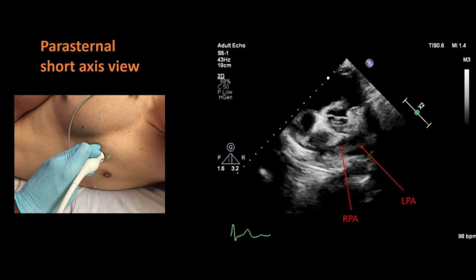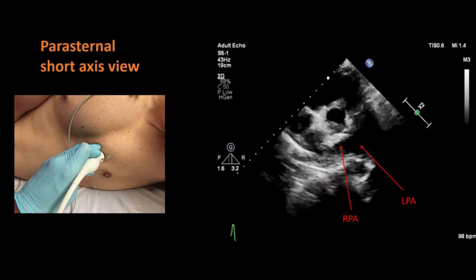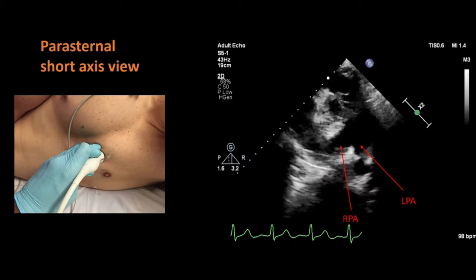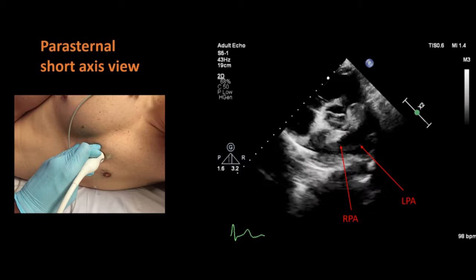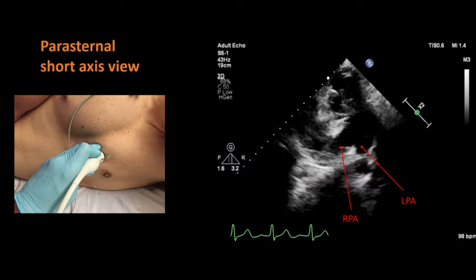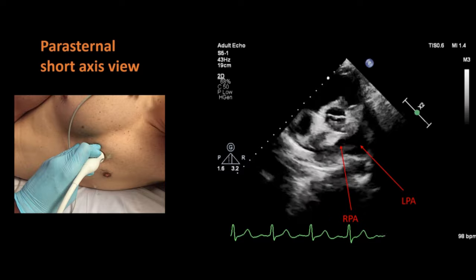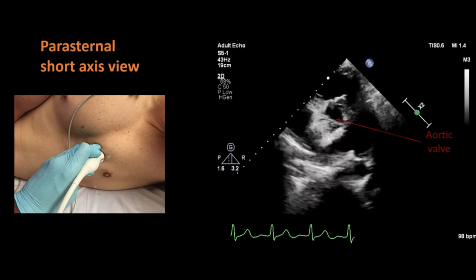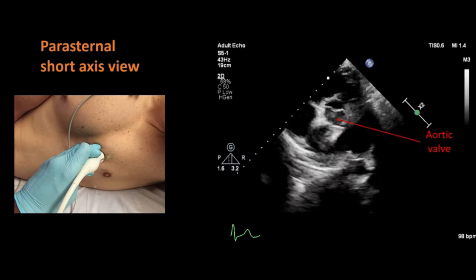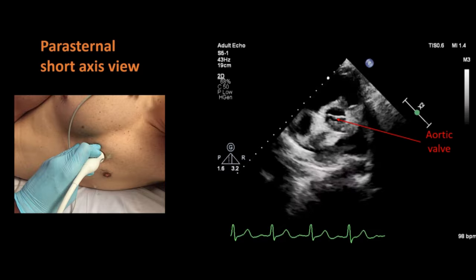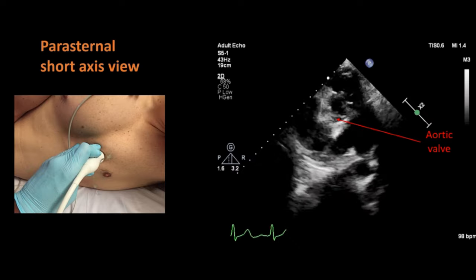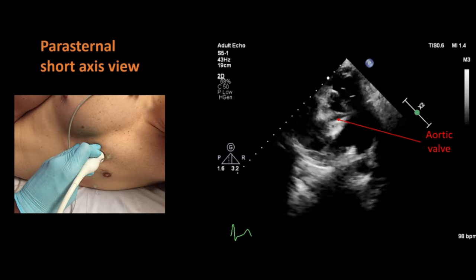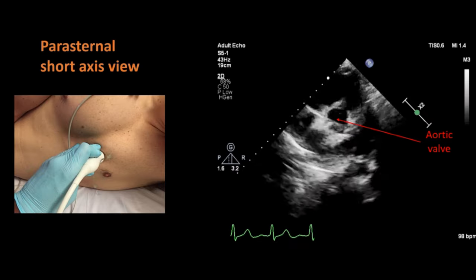You can also see the left atrial appendage with some manipulation of the probe in this view. And in the center of the image, we can see the aortic valve. This is the most commonly used view to see the function of the pulmonary valve.